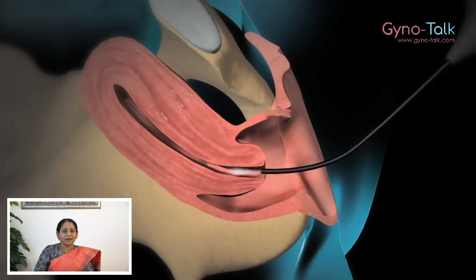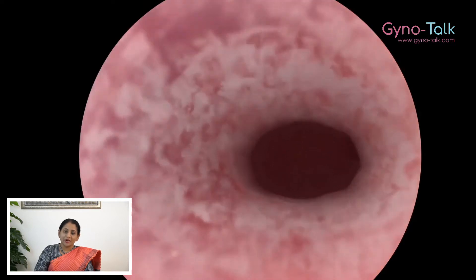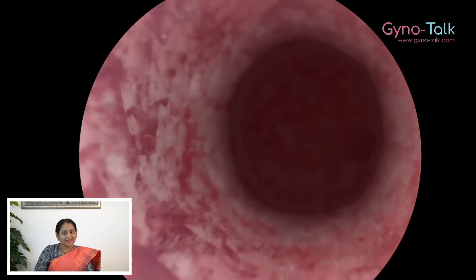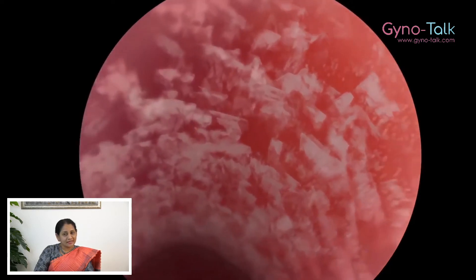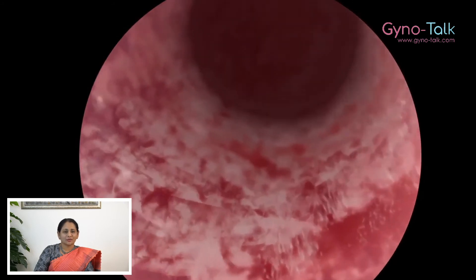How is it done? The hysteroscope is carefully passed through the vagina and cervix into the uterus. It has a video camera inside which sends pictures to a monitor. The hysteroscope has a special channel that allows passing of various instruments so the doctor can perform certain procedures.